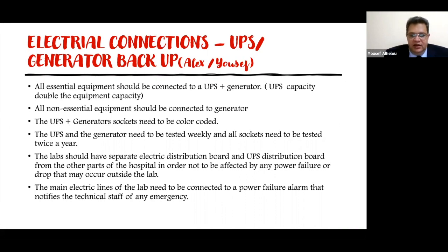And in addition, the last point is the regular maintenance of the UPS and generator, and we should have enough petrol for the generator in case we have a power failure for a long time.